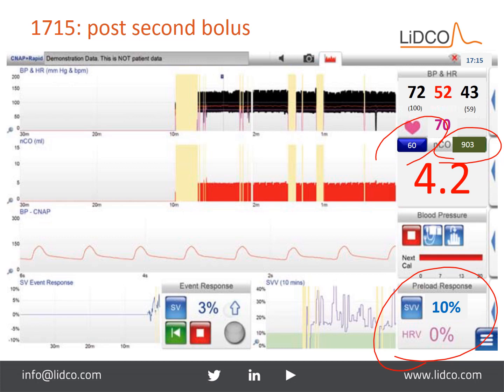And we know through numerous research that the deeper that waveform, more than say 13%, for example, the more likely the patient is to respond to fluid. Conversely, if that waveform is flatter, the patient would be less likely to respond to fluid, and in this case it's less than 10%. So our patient may or may not respond to fluid, but is on the side of most likely not responding to fluid. Yet we're still concerned about his perfusion. So what are we going to do about that? Well, it might be an indication that we start a vasopressor. Keep in mind, blood pressure is tone. It's either obtained by volume or by giving medication, as in a vasopressor.